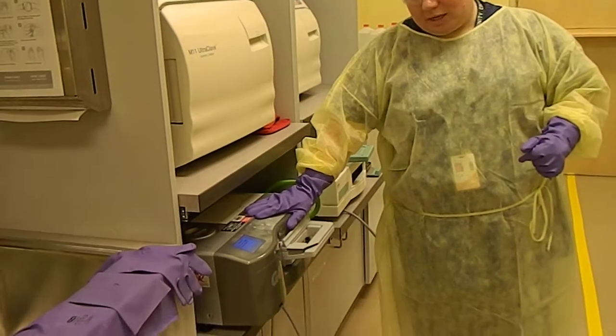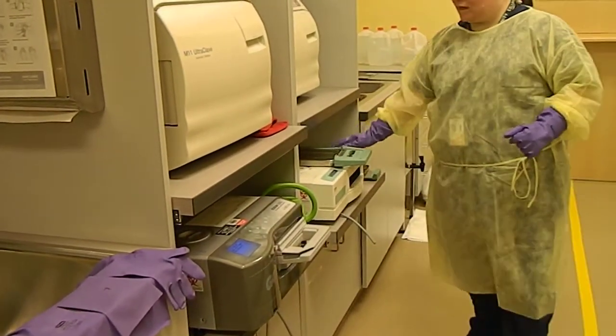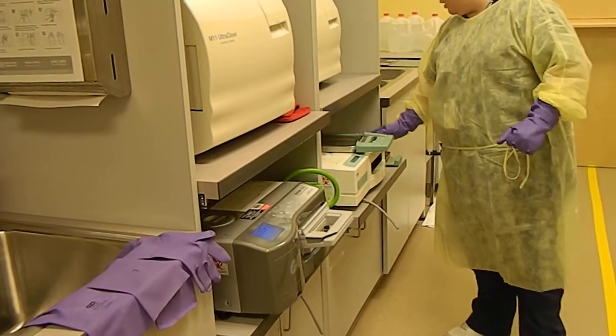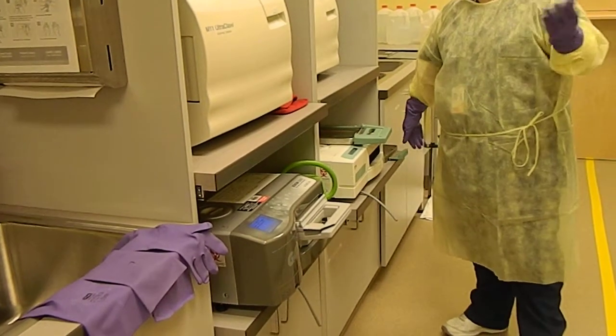This is our large Statim and this is our small Statim. You can fit a whole lot more into the large one, but we do use the small one as well for XCPs and other small things.